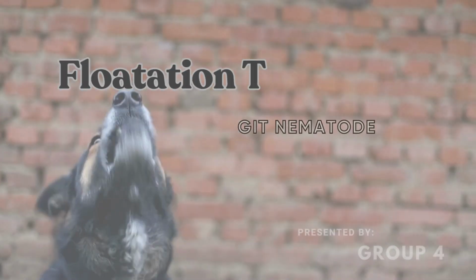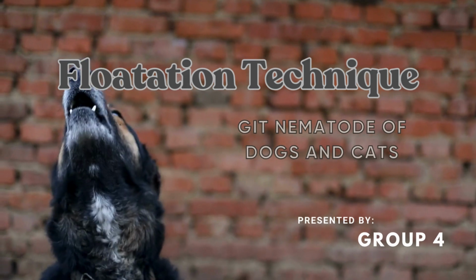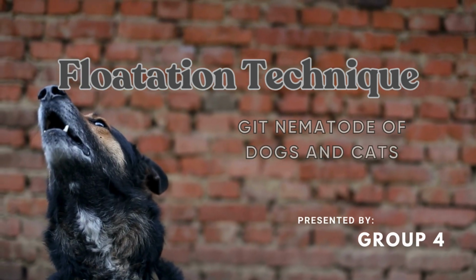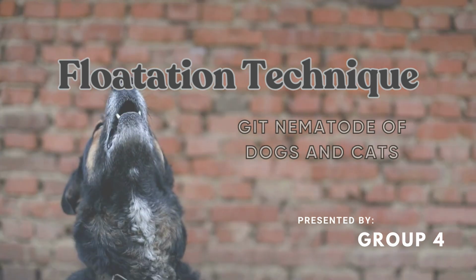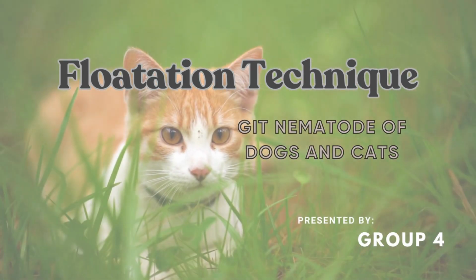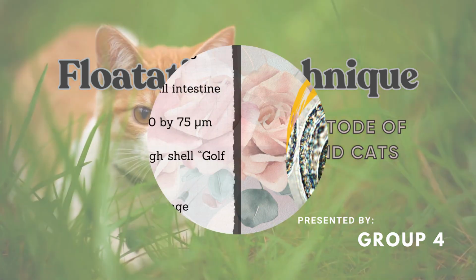Hello everyone, in this video I will tell you what are the different gastrointestinal parasites that infect dogs and cats. I will also show the procedure for performing a flotation technique to identify the parasites present in the fecal sample.